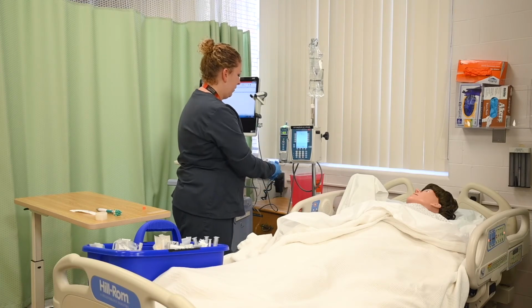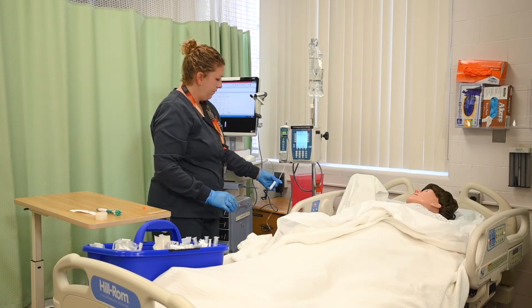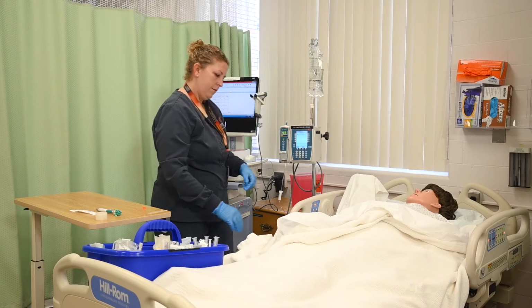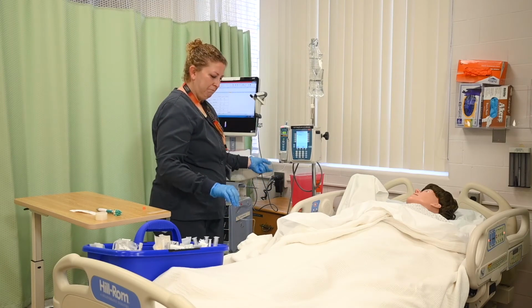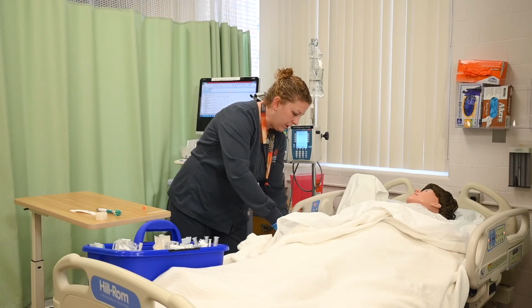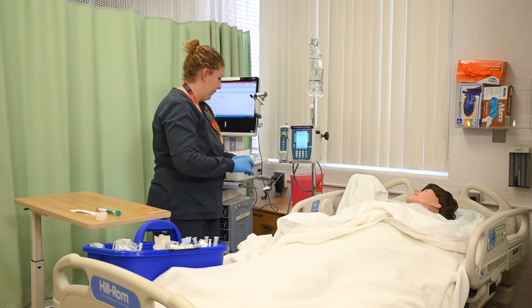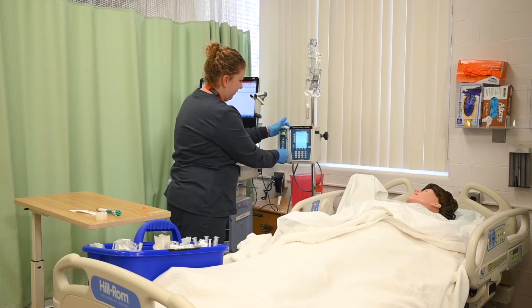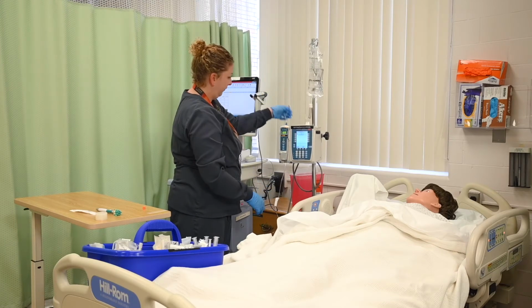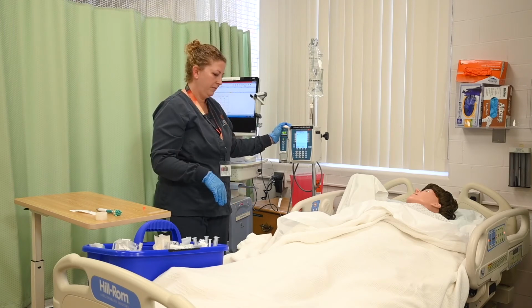I'm going to start the pump, verify the clamps are open. Watch for a green light. To troubleshoot, I'm going to check my IV catheter, my connections, my slide clamp, my roller clamp, and lastly make sure the tubing was inserted correctly. If everything looks okay and the pump continues to not infuse appropriately, I might change pumps. Label the primary IV tubing.